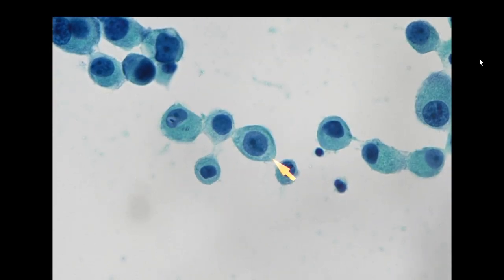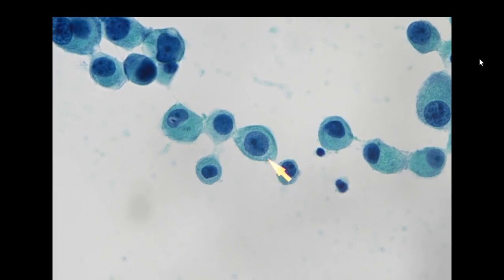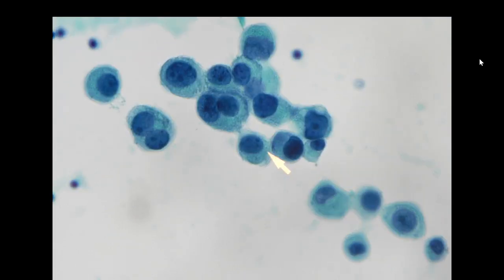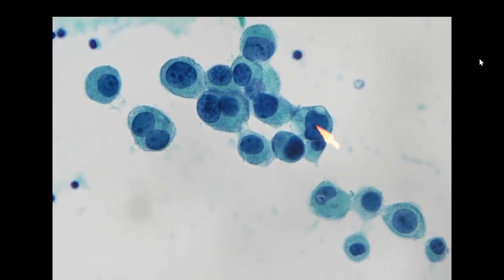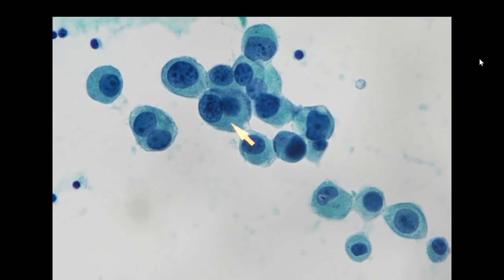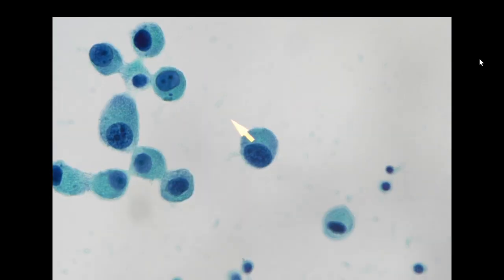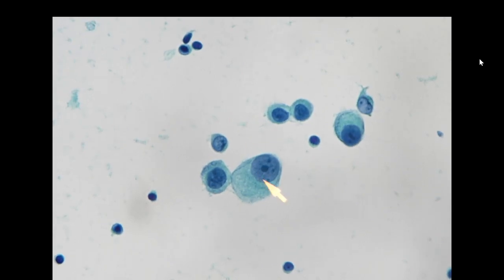That would be very difficult because the nucleus is centrally located, and it also seems to have a double contour over the cell membrane. So if you ask me about the individual cell, could it be a reactive mesothelial cell? I have no idea. But if you take a look at the overall picture, and compare the size of the adjacent lymphocyte, I think most of the cells are metastatic adenocarcinoma. So this is an example of a poorly differentiated adenocarcinoma with pleural effusion involvement.